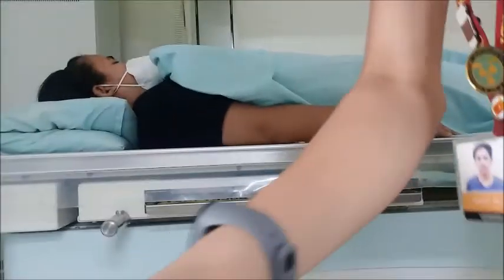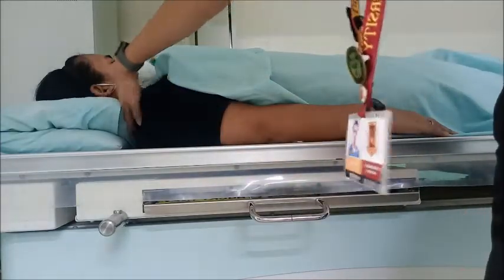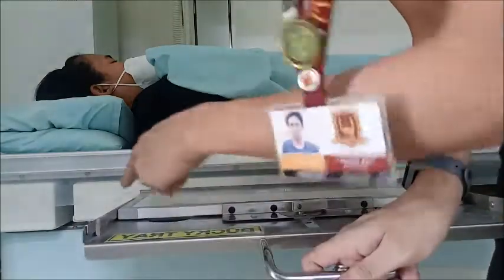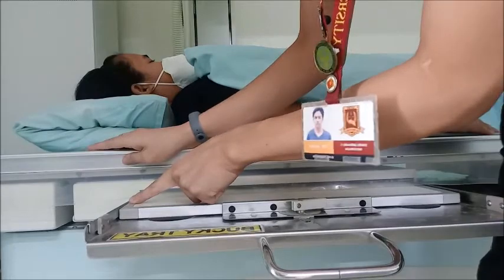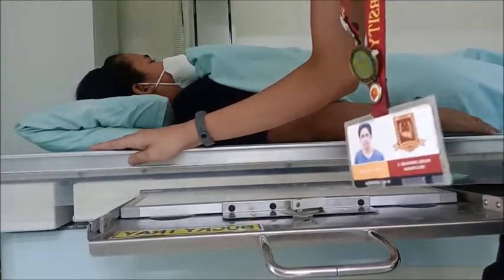Siya. Tap sa shoulder ni patient. Na siya. At approximately at the level putsad. Approximately 2 inches above ana isang yahang C7. So dapat ang edge sa ito ang IR should also be approximately at that level. Nasa C7.